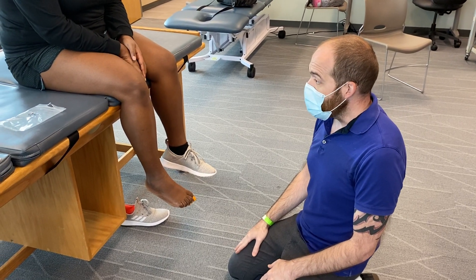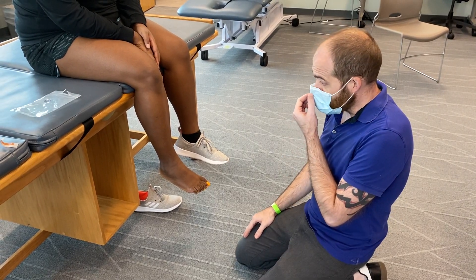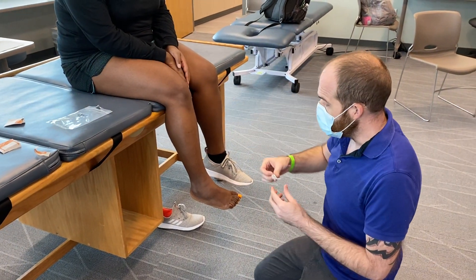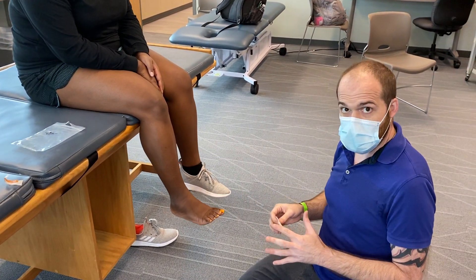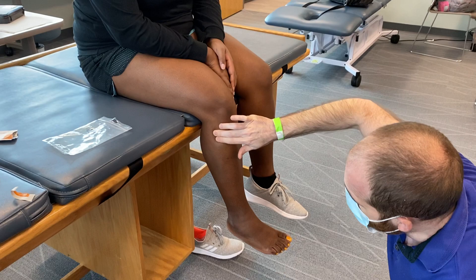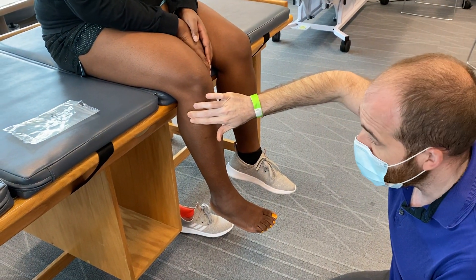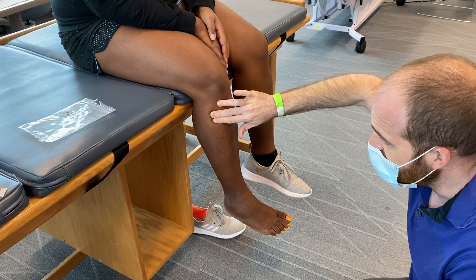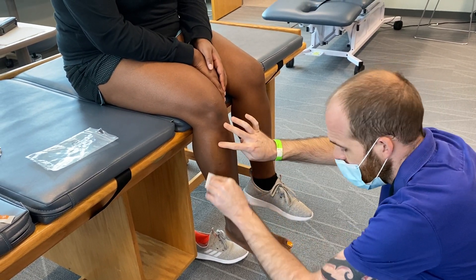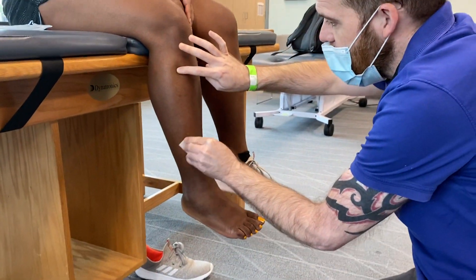I'm going to show you how to do electrical stimulation to get ankle dorsiflexion using Ola's right leg. Typically where you start, you find the head of the fibula, then go just maybe one finger width down below it and about an inch toward the front, and you'll be on the belly of the anterior tibialis. Put one electrode there and another a few inches down the leg.